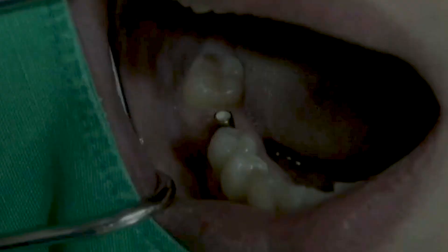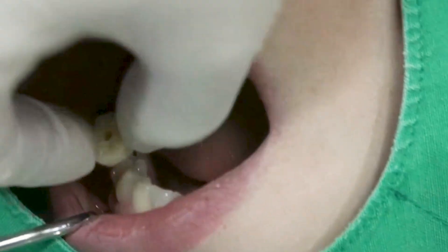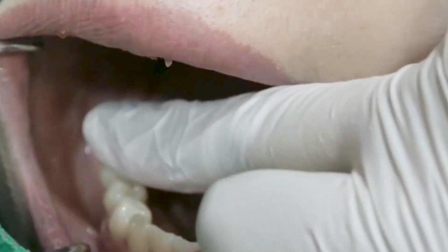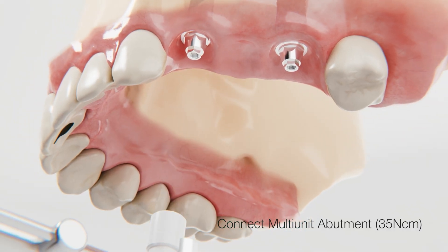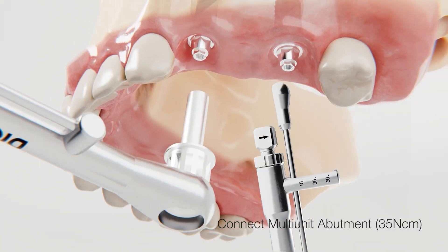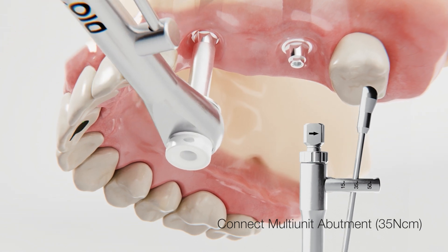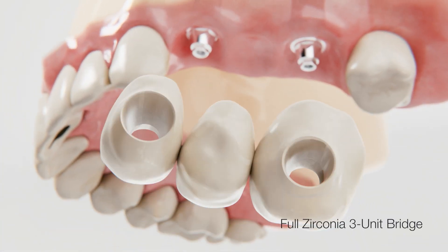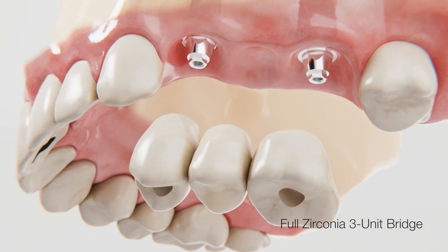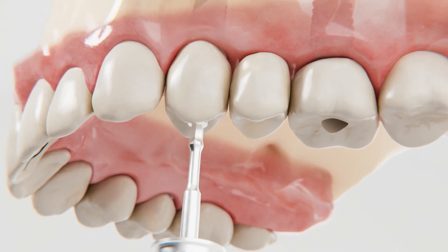Next, let's discuss molar implants. These are dental implants used to replace molars, which are the larger teeth in the back of the mouth used for chewing. Molar implants are typically larger and stronger than anterior tooth implants, as they need to withstand the force of chewing. They are also placed directly into the jawbone and topped with a custom-made crown.